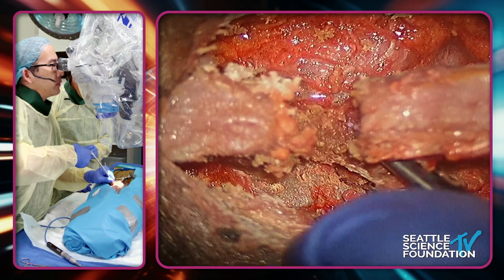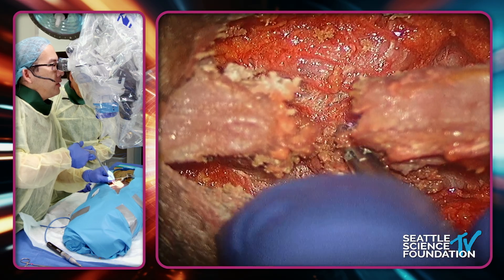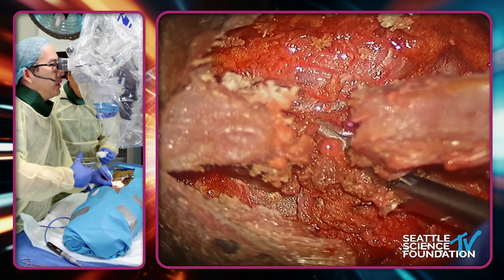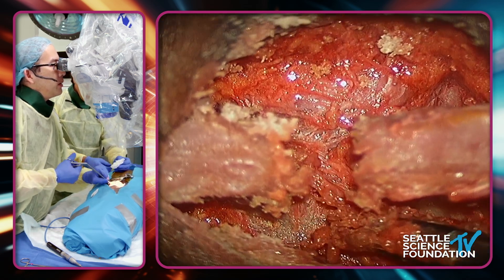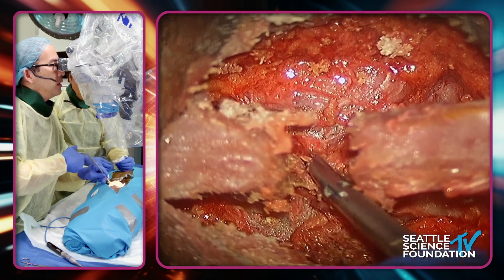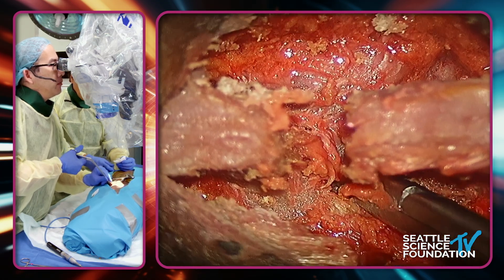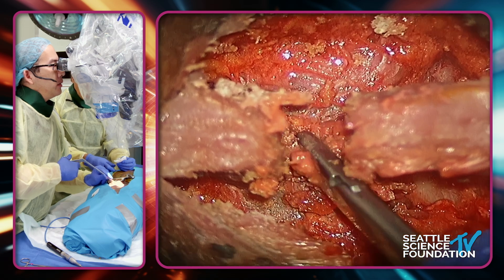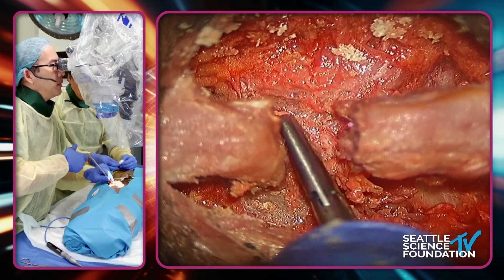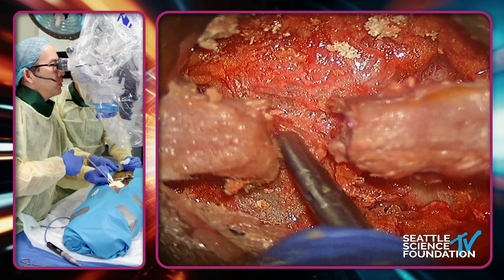If you have to take the spinous process, do you preferentially take it from the inferior or superior spinous process to fit the CoFlex? Yeah, that's a really good question. In general it tends to be the superior spinous process. However, if you're doing a two-level case, you really want to preserve the one that's in the middle because that's where you're going to have the fracture because of the tension. Some people will use a Leksell rongeur, which is about that same width, but I worry about cracking and compromising the spinous process when I do that.